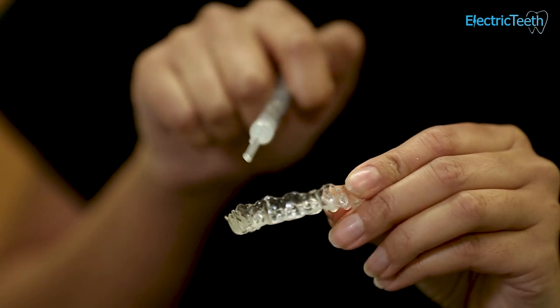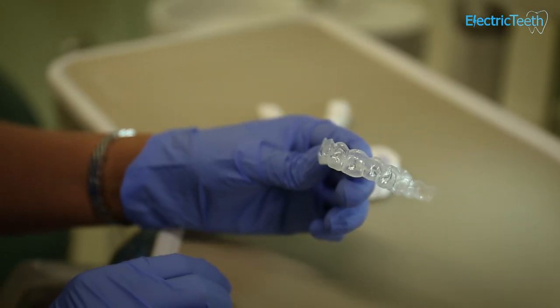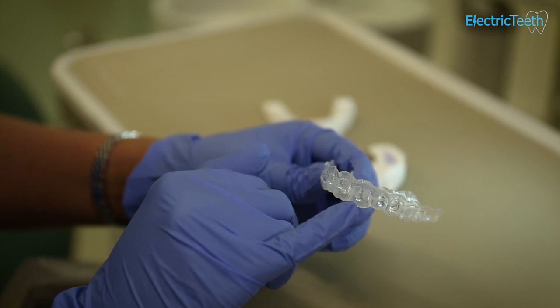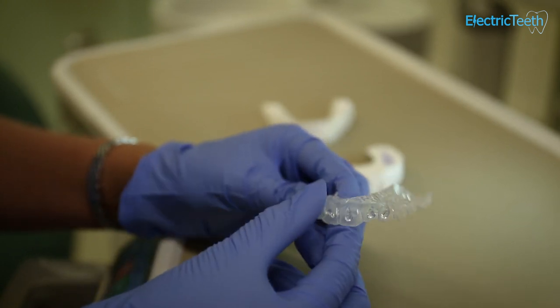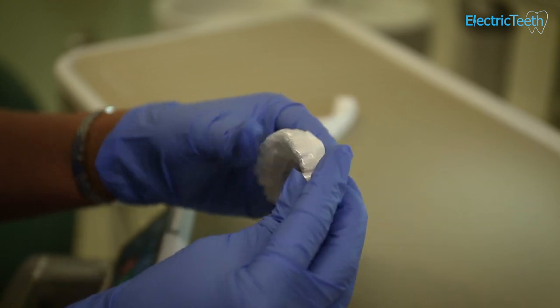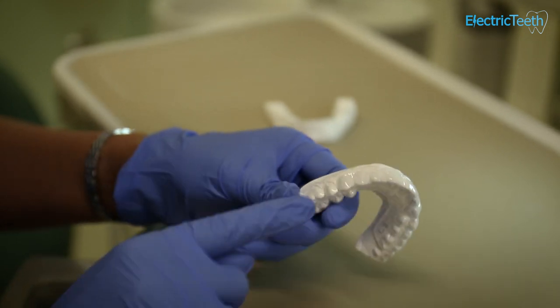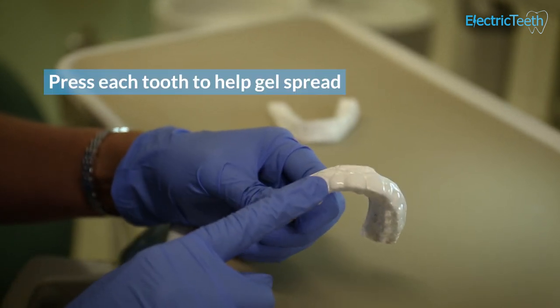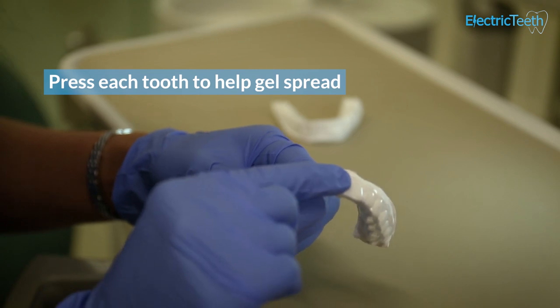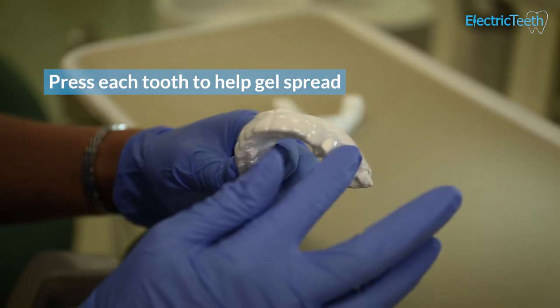Once you've filled them up — you can see how much gel there is — I always try to place the gel into the center of the tooth or towards the incisal edge of the tooth. You then put the trays into your mouth. This is an example of the patient's mouth — these are her models. Then you press each tooth to allow the gel to spread across the tooth and it's got really, really good close contact.